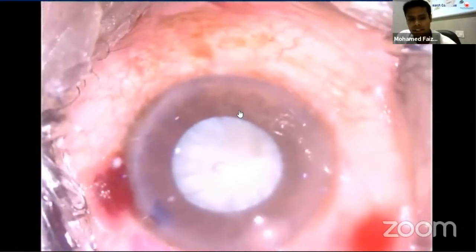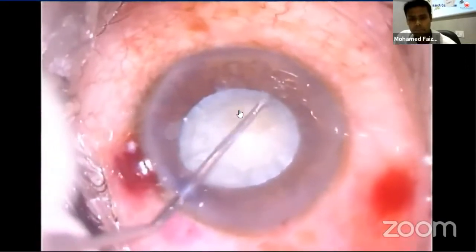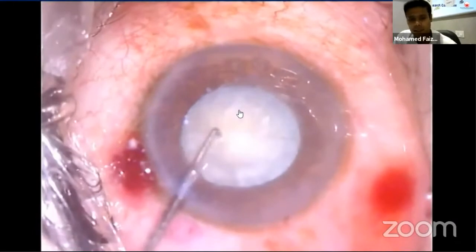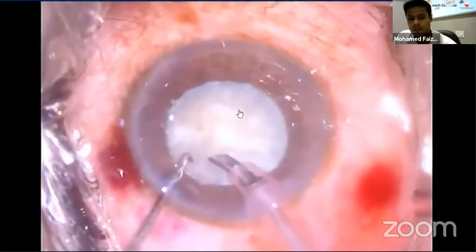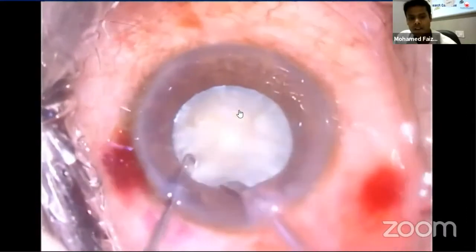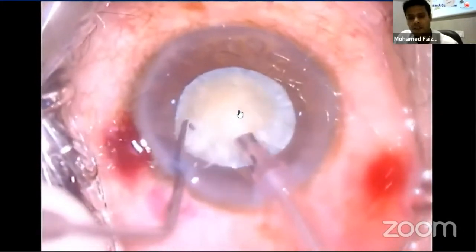Then come the FACO settings: moderate flow, low vacuum and continuous FACO power are needed. Power used is based on nuclear density — harder nuclei need higher power, as insufficient power causes the FACO probe to push the nucleus forward, resulting in zonular stress. First, loose cortical fibers and epinucleus overlying the nucleus should be cleared in foot position two alone or with minimal application of FACO power.